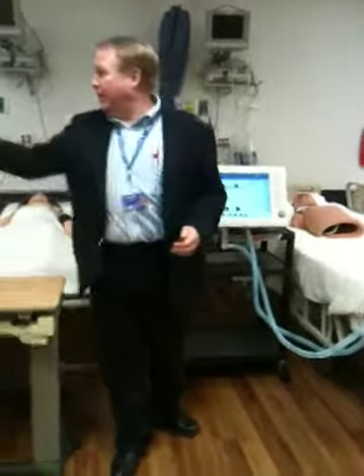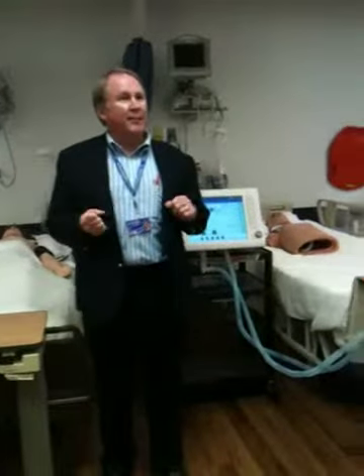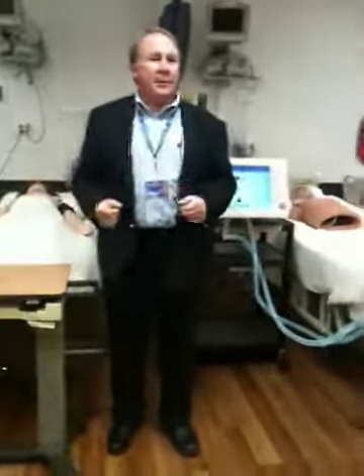This particular ventilator also has a proportional assist. I tell it that I want it to assist the patient, but as long as the patient's doing enough, just give them a little bit of help. Then I can look at a graphic over the last 8 hours, or the last 2 hours, or the last 1 hour, and see what percentage of the work was being done by the machine and what was being done by the patient.